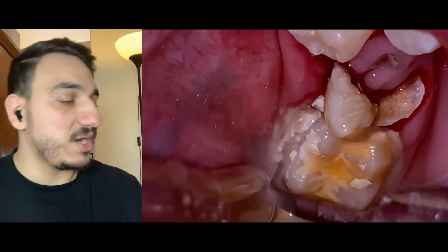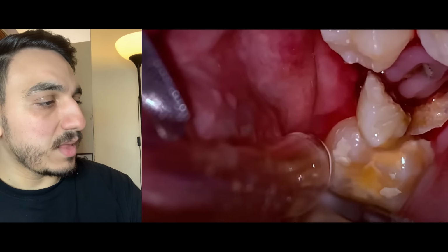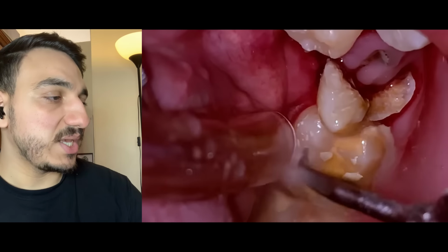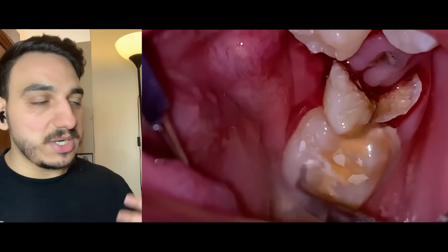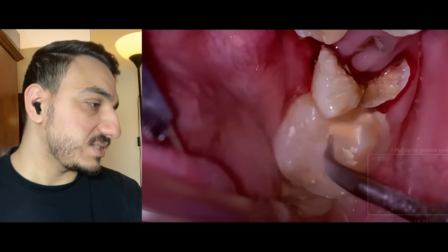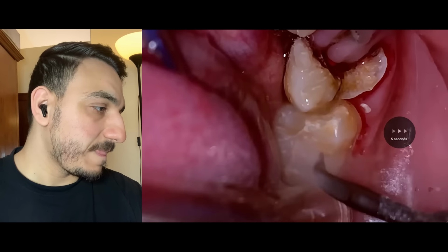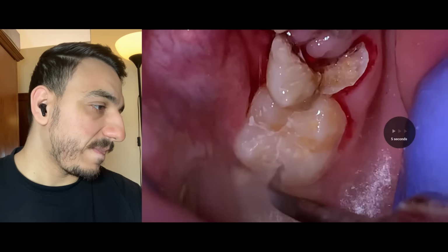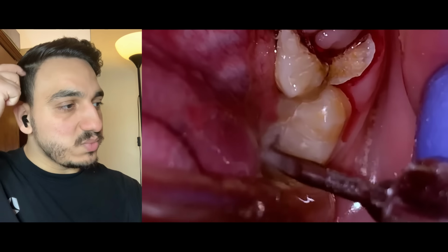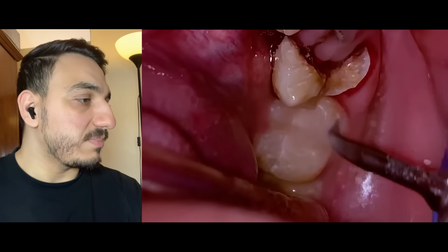Again, the operator here, look at the dental calculus not only accumulating on the surface of the teeth toward the outside or the inside, but also accumulating on the surface that we actually chew on. It's really interesting. The operator here is doing their best to remove all of this. Gonna fast forward this a bit. So the operator here is working really hard on that molar, and the gums look like they're inflamed on that particular tooth.